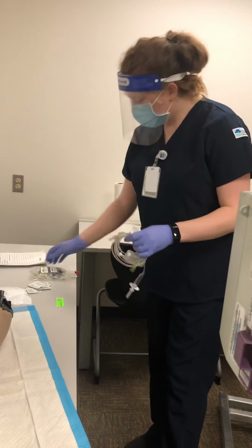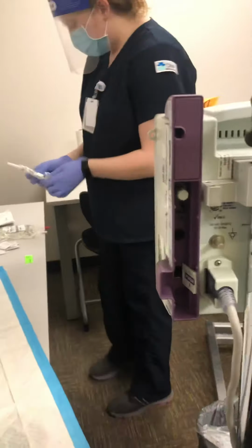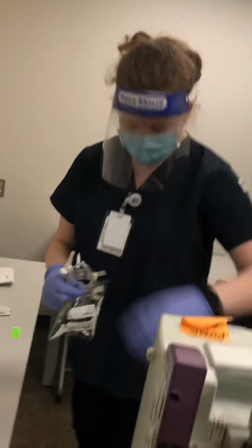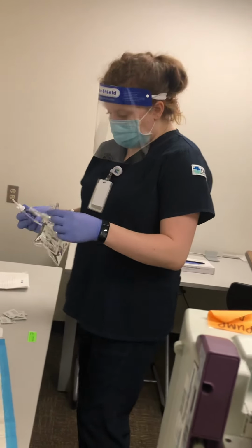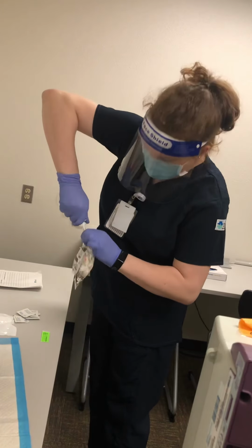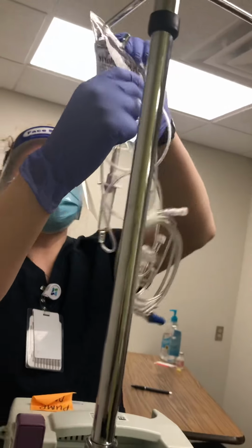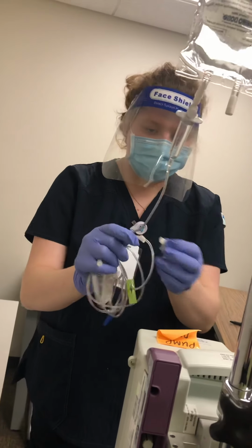Okay, so this has a cap on it, and this has a cap on it, which means we do not need to clean either end as long as we don't touch them to anything. Take them off, and I'm going to spike my bag. All right, perfect. Now we're going to hang our IV bag, and now we need to prime our line.